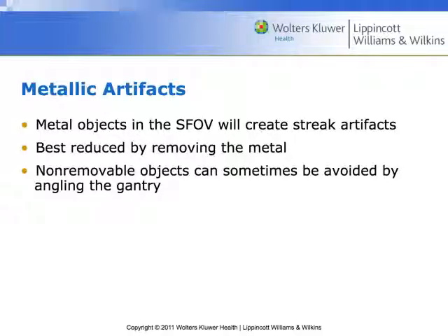As a rule of thumb, though, I typically do not ask female patients to remove any piercings below the nipple line, right? Or maybe below even the shoulder line, right? You will get those patients who ask you all those questions. Please let them know it's probably just fine. We should be able to see everything that we need to see.